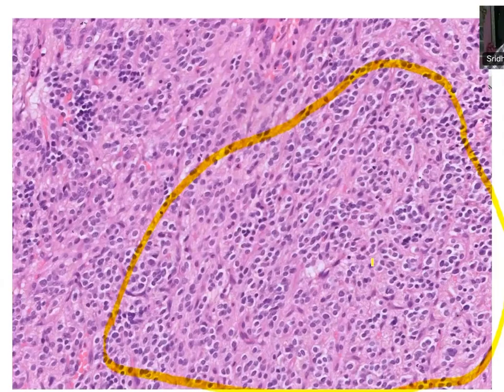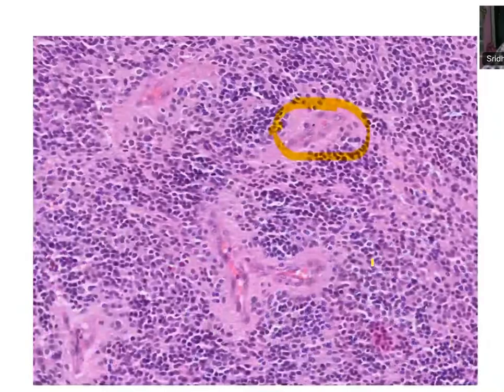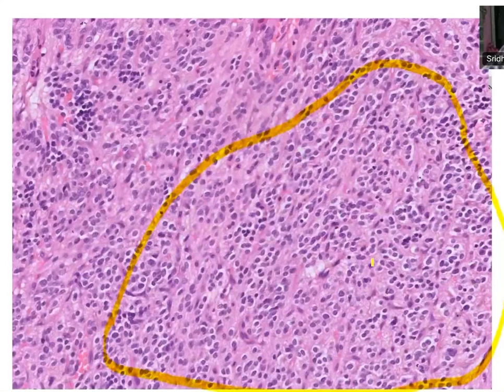So a 14-year-old with a supratentorial located tumor. The tumor is very cellular, and the matrix is fibrillary. So what is your summary? Is it a low-grade or high-grade tumor? First and foremost, is it a tumor or not? Yes, sir, it's a tumor. Cellular tumor means what type of tumor? You have glial tumor, embryonal tumor, glioneuronal tumors.